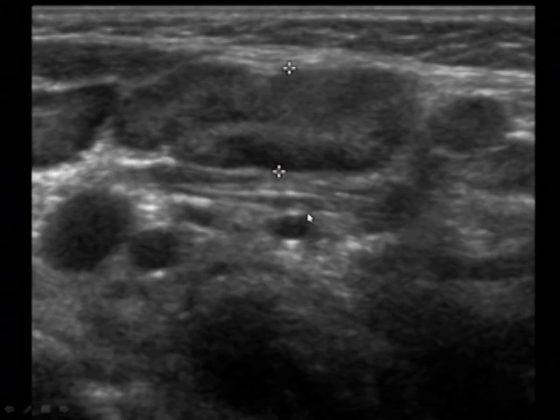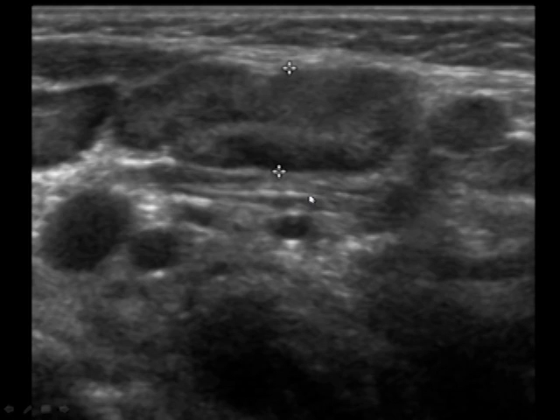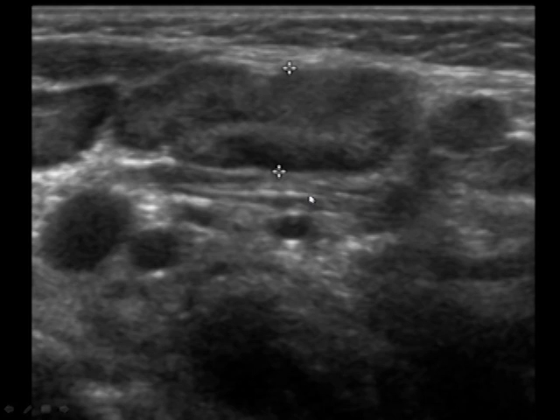This is an ultrasound, which is infrequently used for retropharyngeal abscesses, but increasingly done at CHOP because we're trying to avoid CT-level radiation to the thyroid of young children. Thyroid tissue is very radiosensitive.